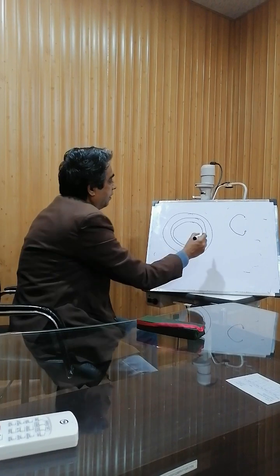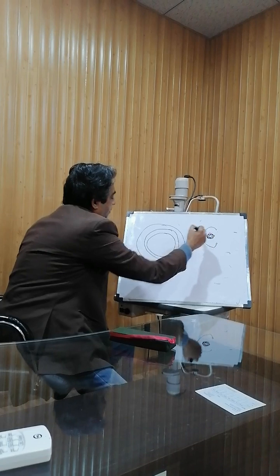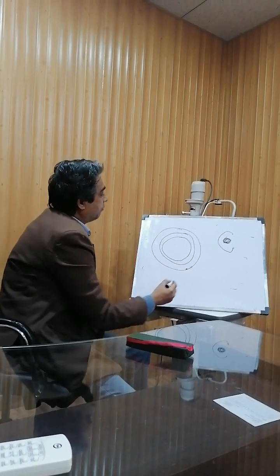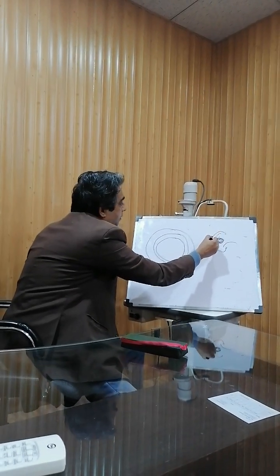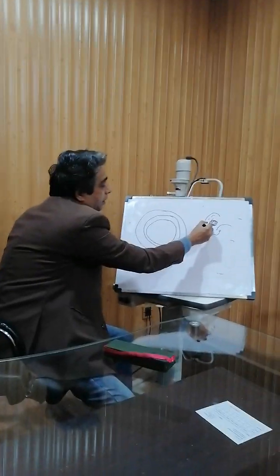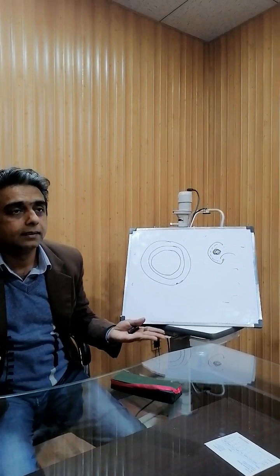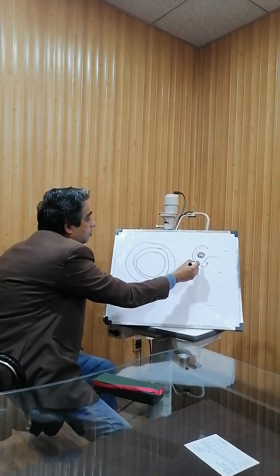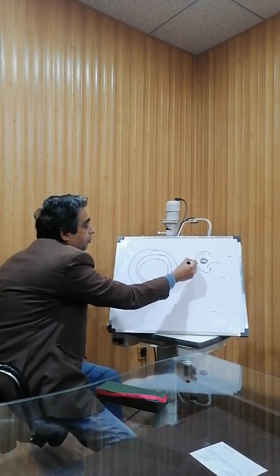Now, what are we left with? We are left with the nucleus. Now, what will we do? The next step: through this incision, we will inject water between the posterior capsule and nucleus, so that it is called hydrodissection. Dissection by water. It will remove the adhesions between the cortex and the nucleus and the posterior capsule.